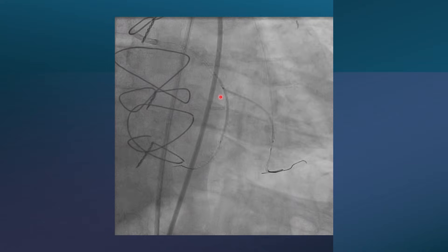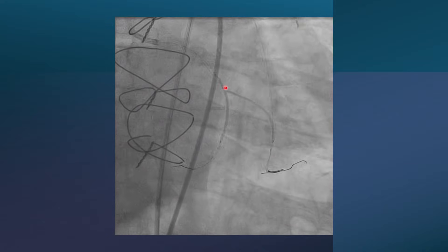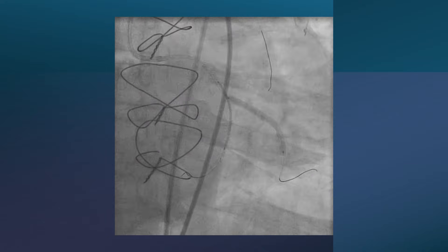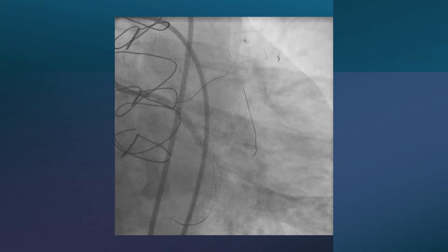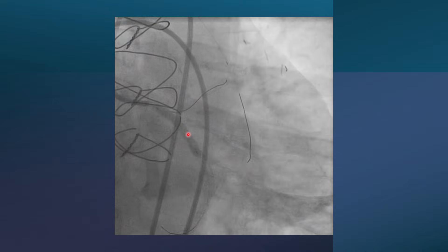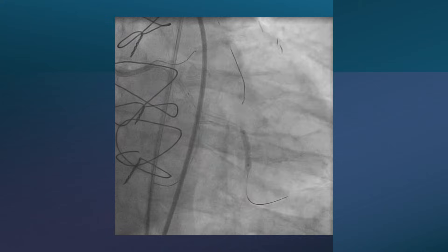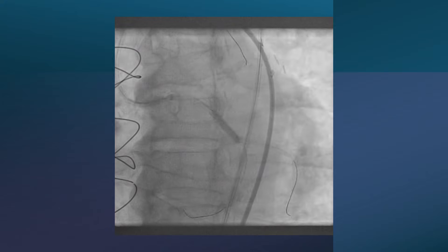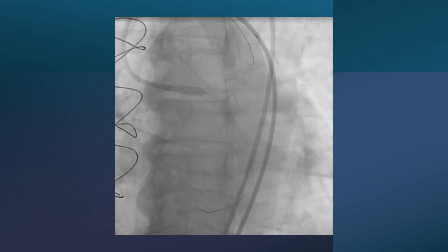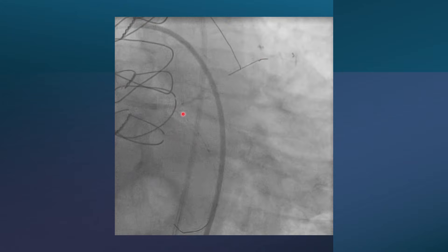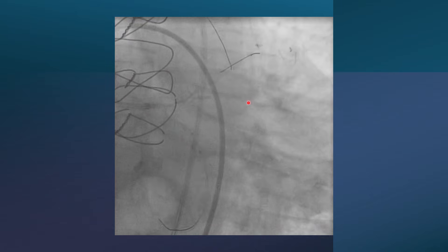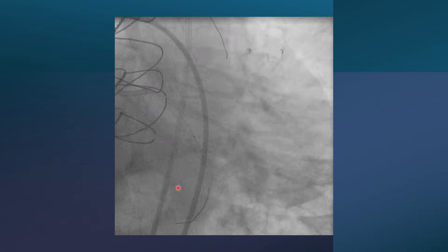We placed a stent distally, then used two stents for the OM and circumflex with a mini-crush technique: the OM stent was inflated and then crushed, followed by another stent from the circumflex to the left main stem. We then performed kissing balloon inflation, post-dilation, and POT for both the circumflex and the left main stem. We also crossed into the LAD to open the ostial LAD, anticipating the patient may require future PCI for the LAD, and performed a final POT.